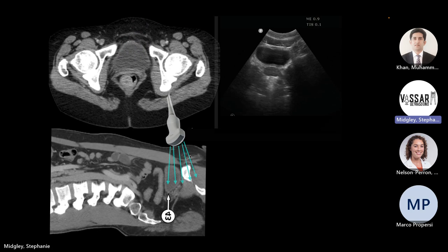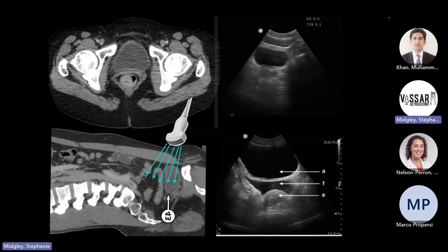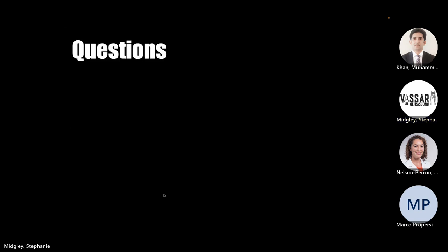And then, right, free fluid is going to live on the top of the bladder, which again, anything that's further away from the ultrasound probe, right? So further away is going to show up deeper. So for this one, when we're looking for free fluid, it's going to be deep to the bladder. So it's going to track kind of down here and above.